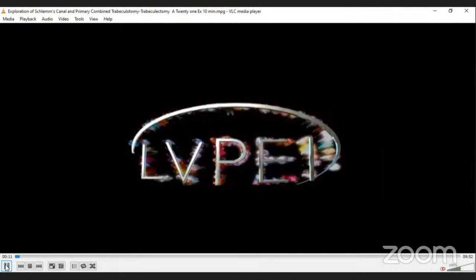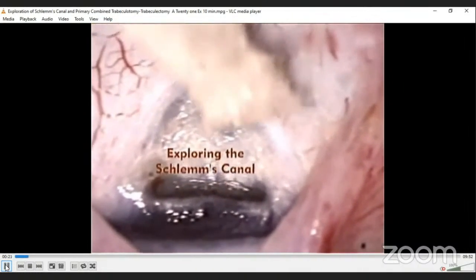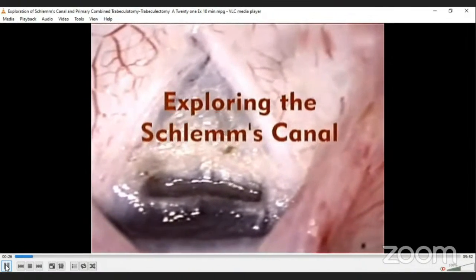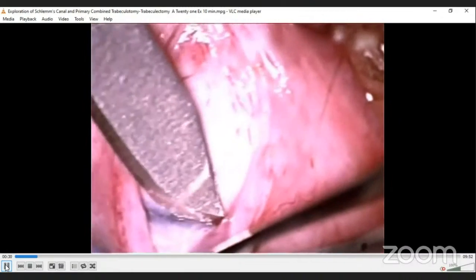So in the video, I would like to present exploration of Schlemm's canal and primary combined trabeculotomy and trabeculectomy for developmental glaucoma. Exploring Schlemm's canal is one of the key surgical steps for doing external trabeculotomy.